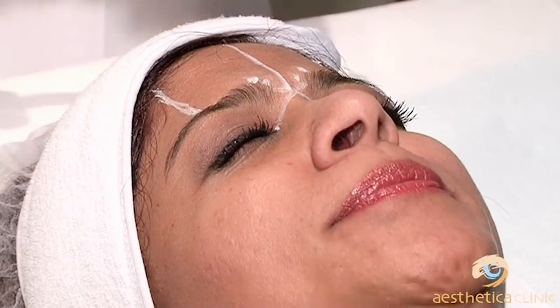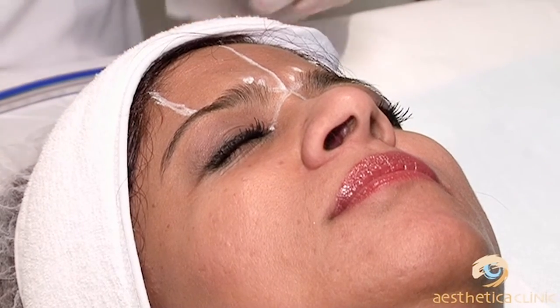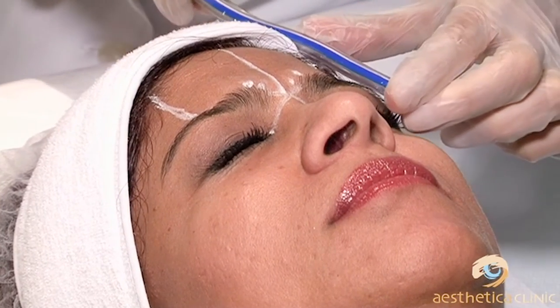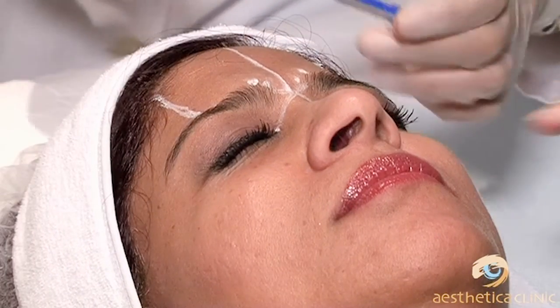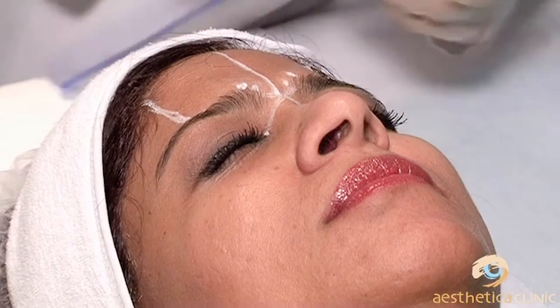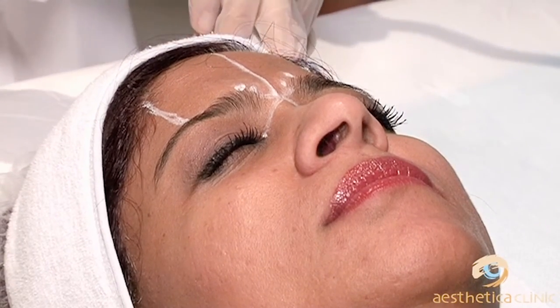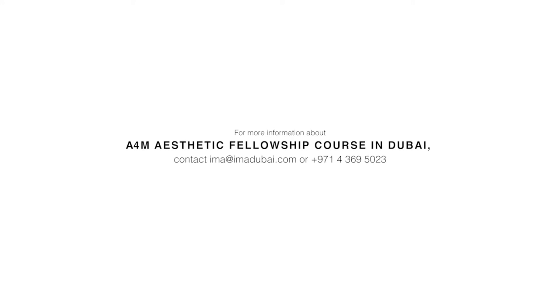In her case, we want some lifting of the eyebrow but not too much, so we will put the point at four and a half centimeters above. This is being done very cookie-cutter, scientifically. From the eyebrow, four and a half centimeters above — she will get nice, symmetrical lifting on both sides. It's high; in her case it's in the hairline, but that's fine.